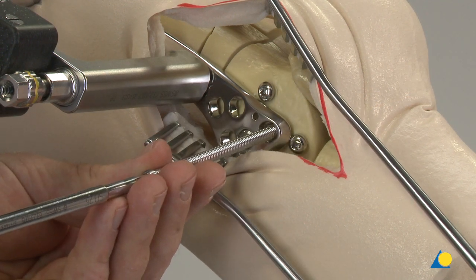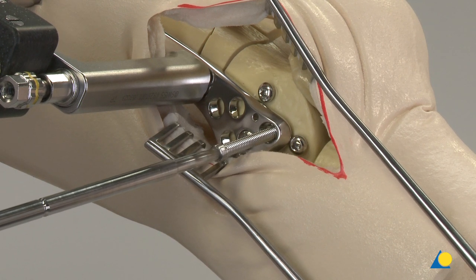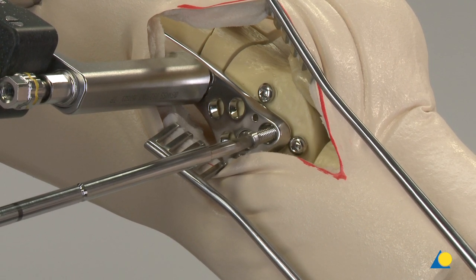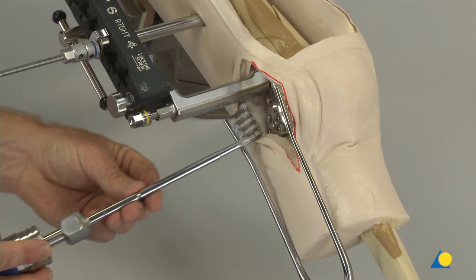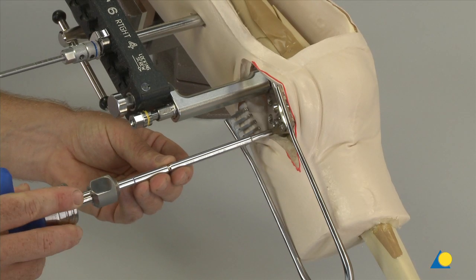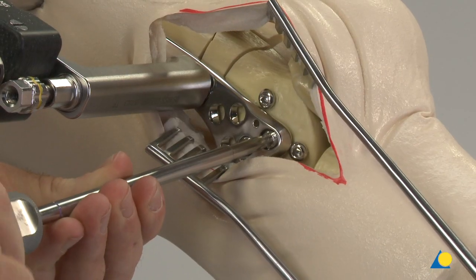Insert the appropriate length 5.0 mm variable angle locking screw using the power tool and the T25 star drive screwdriver shaft. Final tightening must be done by hand using the T25 star drive screwdriver shaft and the T-handle with torque limiting function 6 Nm.